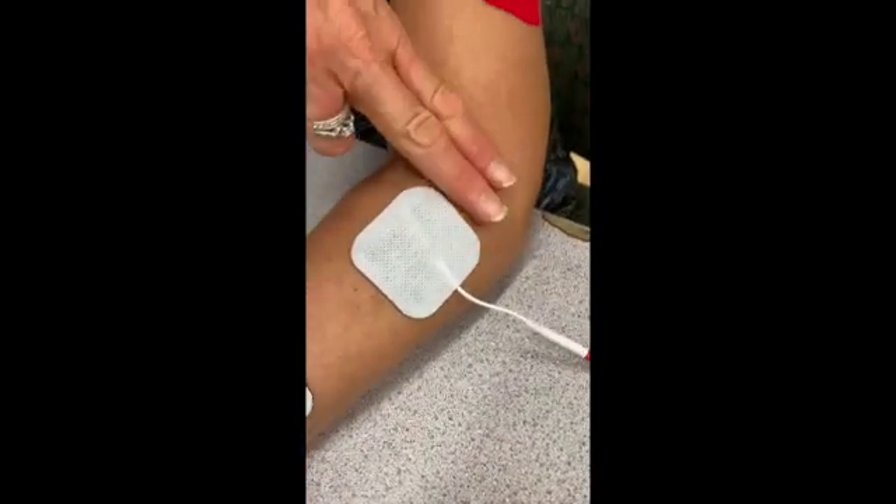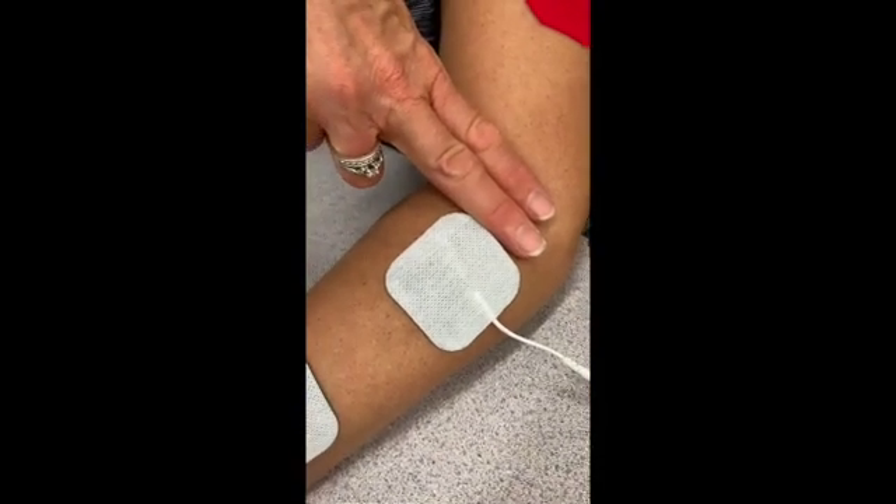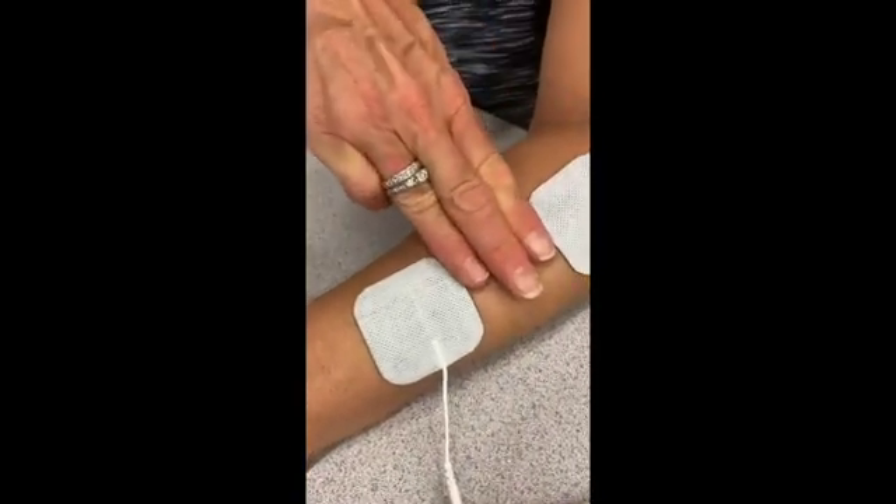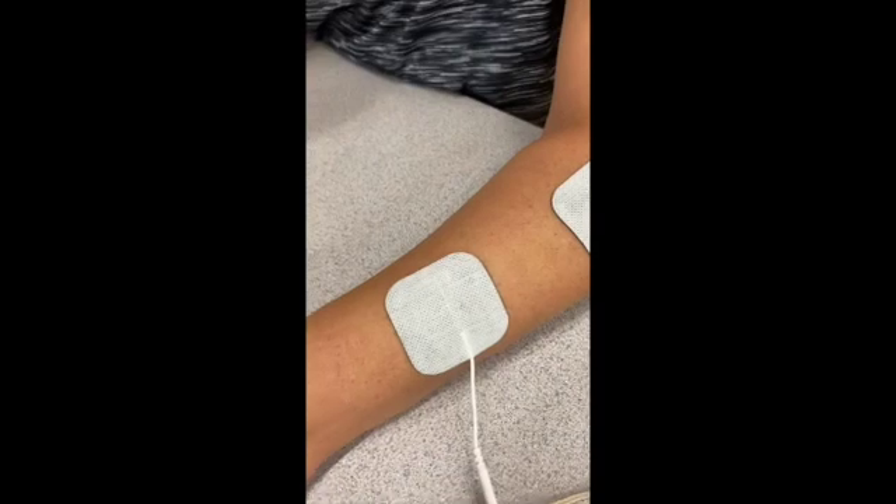The person's arm should be flat on the table with palm facing down. The first electrode pad should be placed about two fingers below the elbow. The second electrode pad should be placed about three fingers width from the first pad.